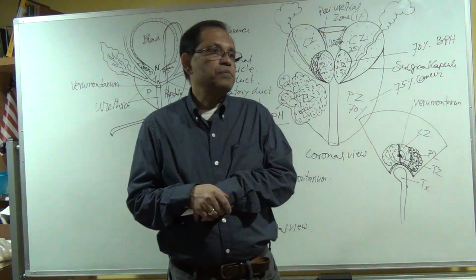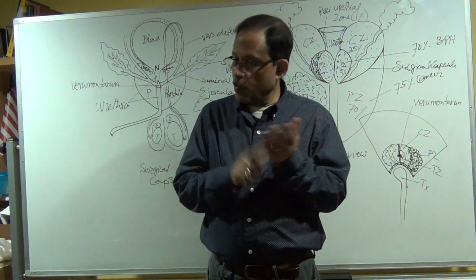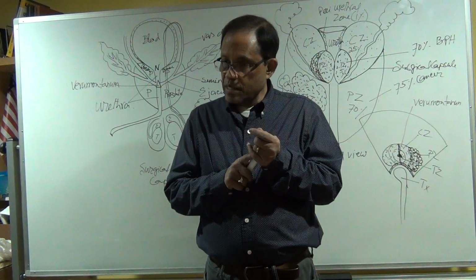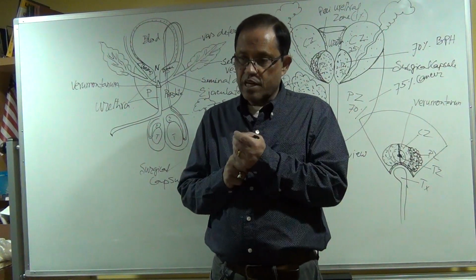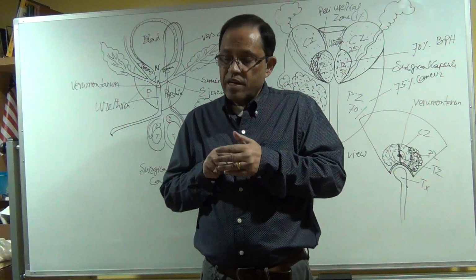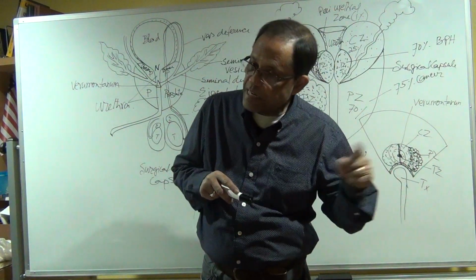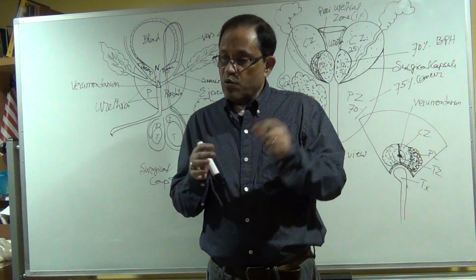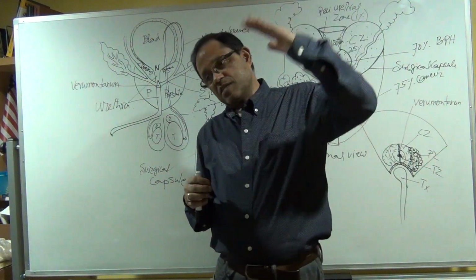Okay, so the scope of ultrasound is follow up. Somebody is getting surgery or is given treatment to shrink the prostate gland, they need to do follow up again. And somebody needs ultrasound guided biopsy. Somebody wants to put the microchips, radiation chips, ultrasound guided.